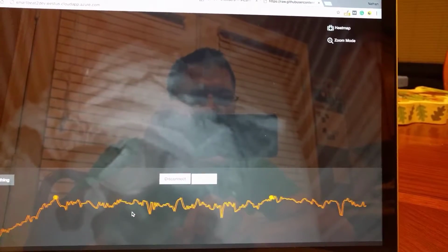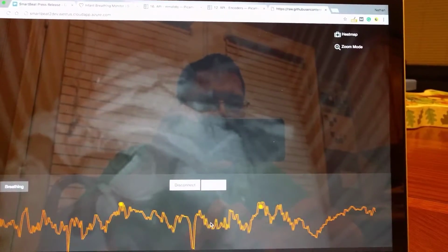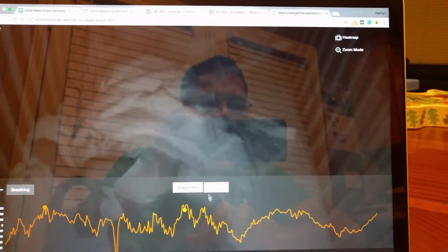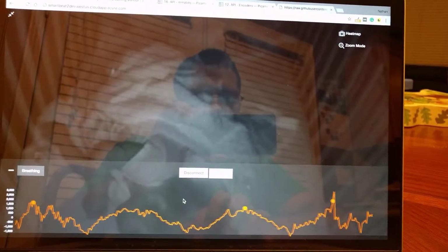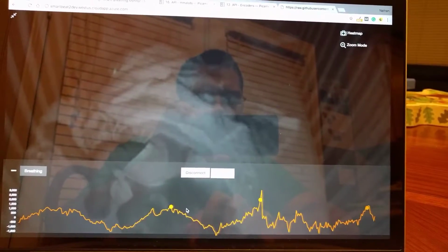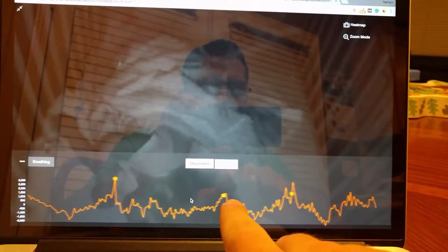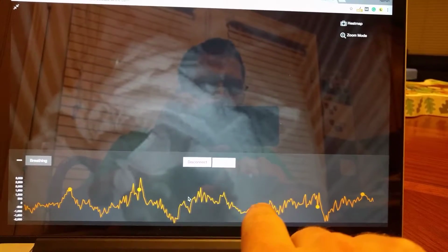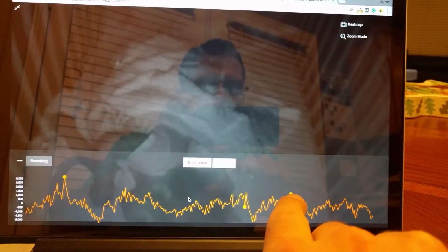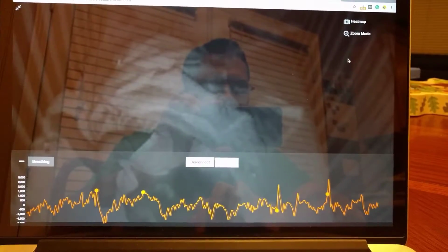So let's go ahead, and now I just changed the brightness, so you're seeing those changes occur right now. But this is the breathing graph, and as you can see, it's a little bit noisy. That's because it is a little bit dark, and she is under a blanket. But these little dots, I don't know if you can see them on the screen, are indicating actual breaths being taken. So even in the presence of noisy data, usually they're going to hit them and you can see the breaths happening there.